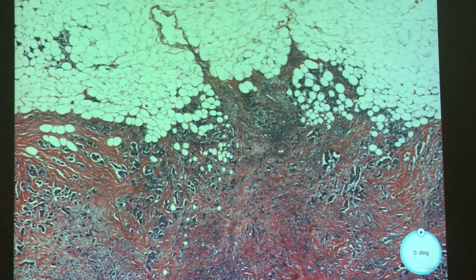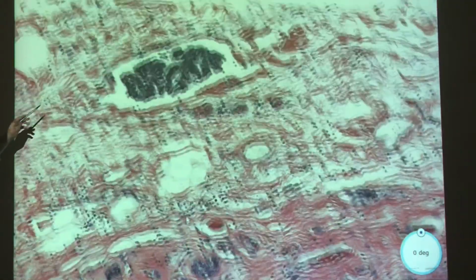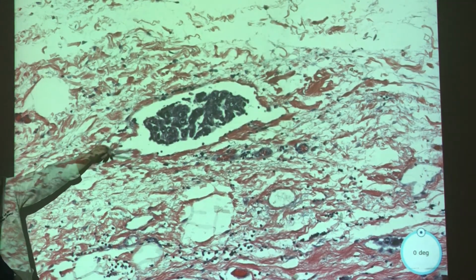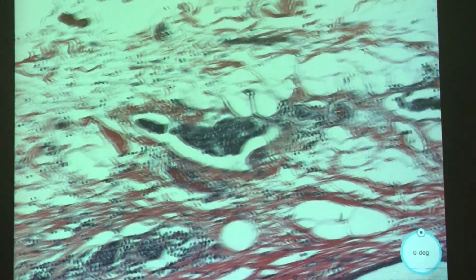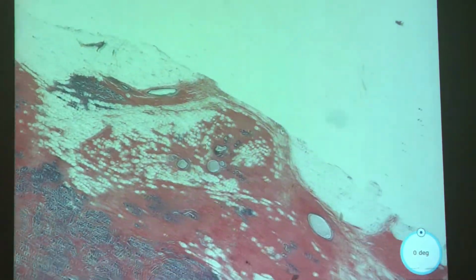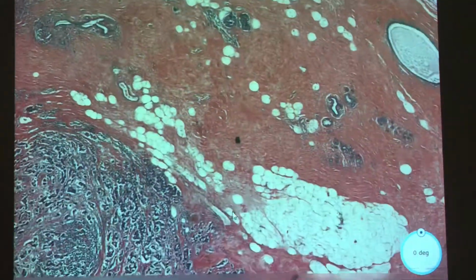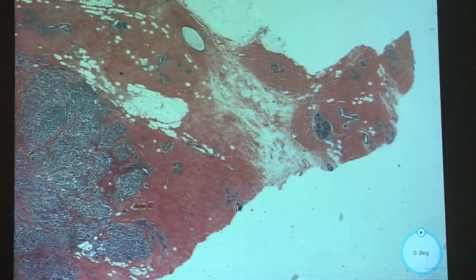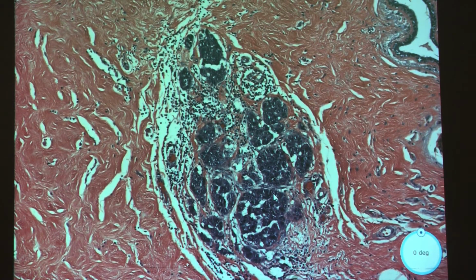Okay. So a couple of things. We do have lymphovascular invasion on this slide, even though it's pretty close, like all these. Yeah, this is lymphatics. And there's some more. So there is some of it, but you believe it more if it's far away from your lesion. Micropapillary carcinoma typically does not have a capsule, which kind of makes sense, right? Because it's kind of just percolating through everything and just, you know, mass destruction as it goes. Like you can see, it's just kind of everywhere.